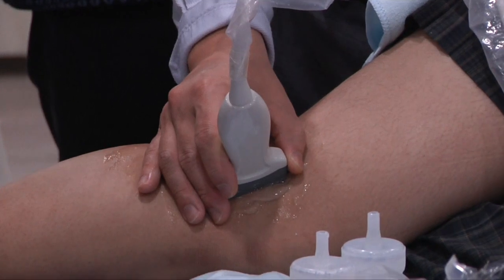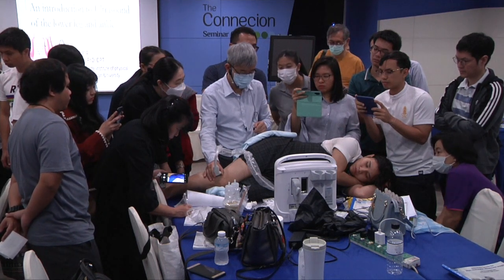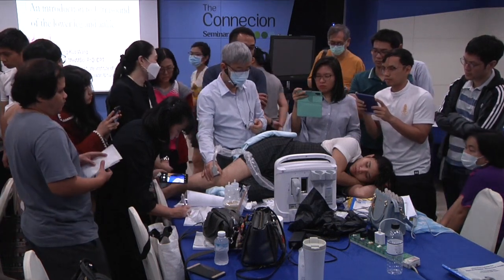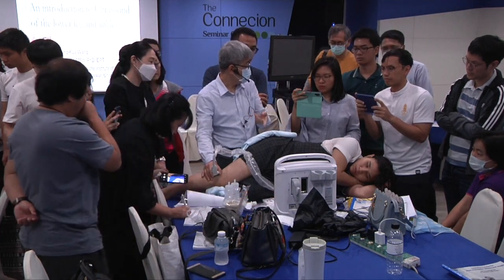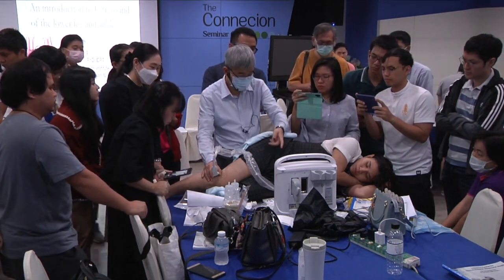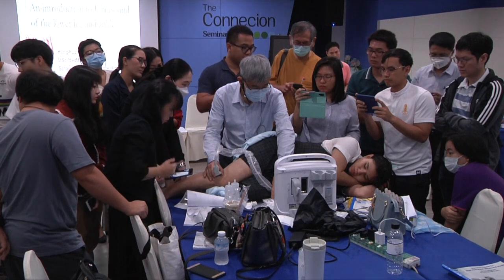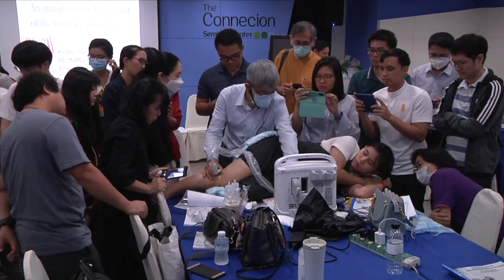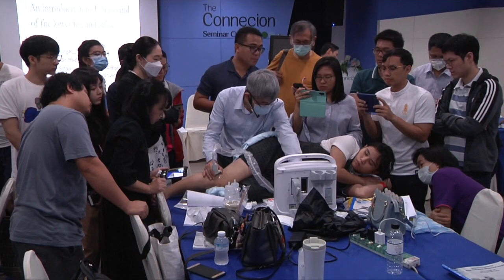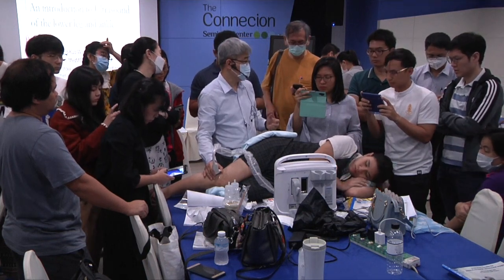Arcuate ligament. We are looking at the arcuate ligament, but we don't know where it is because of the device. Okay. So because no arcuate, this is not the position for arcuate ligament. We don't know where it is because it's not very clear. But if this is the artery, this is the arcuate ligament. We identify the arcuate ligament. Identify the artery first. Okay, thank you.